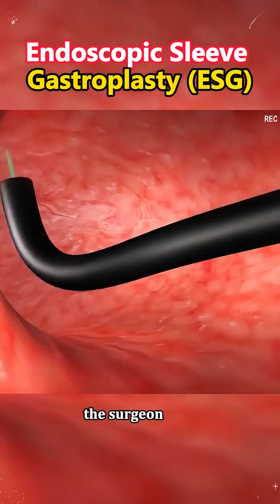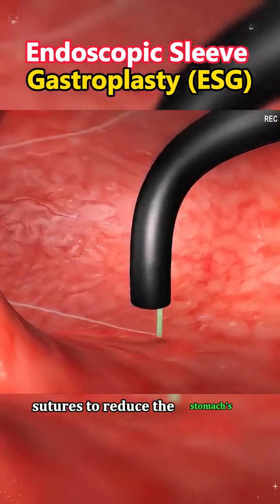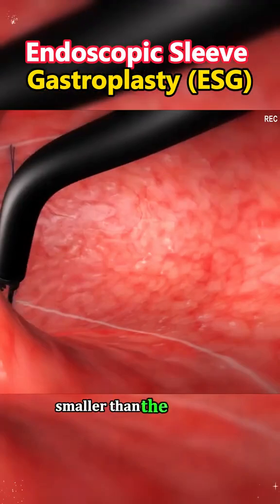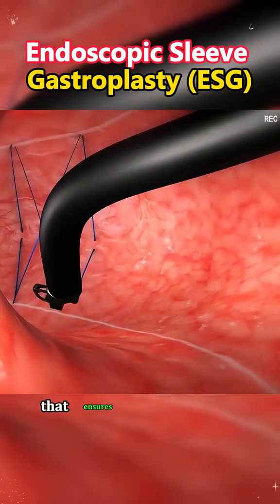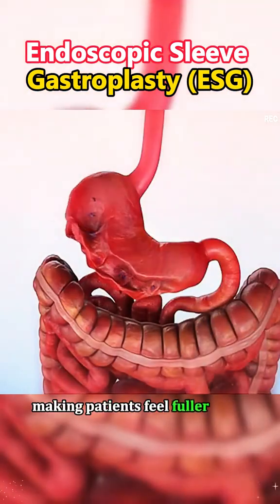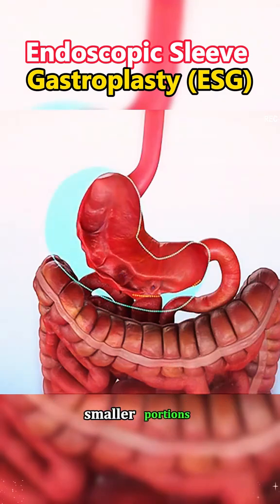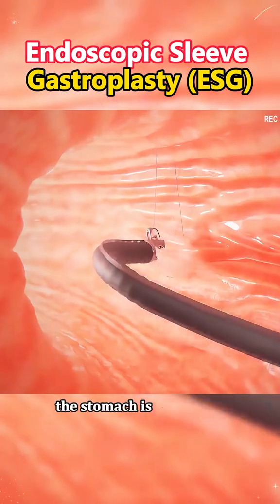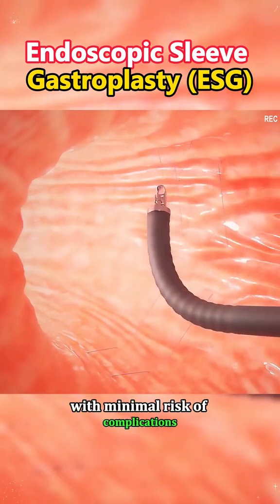Once in place, the surgeon uses sutures to reduce the stomach's volume, creating a sleeve-like shape that is much smaller than the original stomach. The sutures are placed in a way that ensures the stomach can hold less food, making patients feel fuller after consuming smaller portions. This step is carefully performed to ensure the stomach is reshaped effectively with minimal risk of complications.